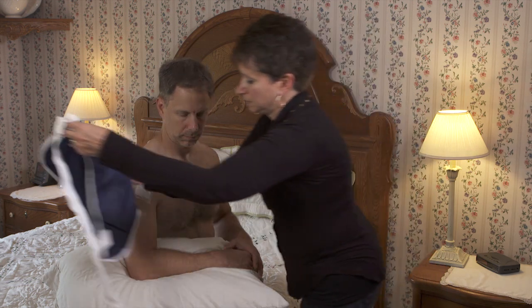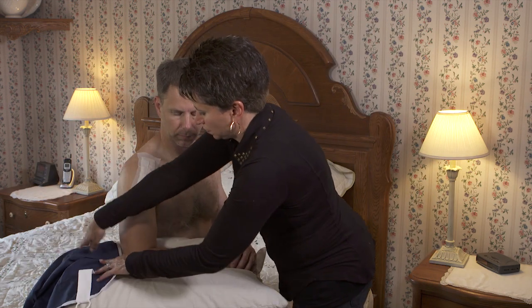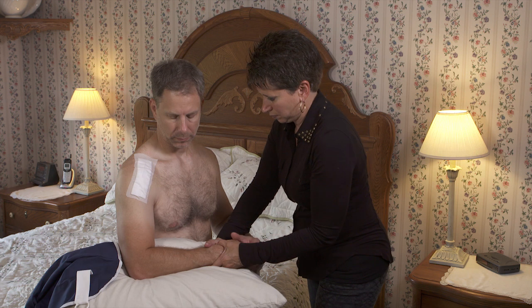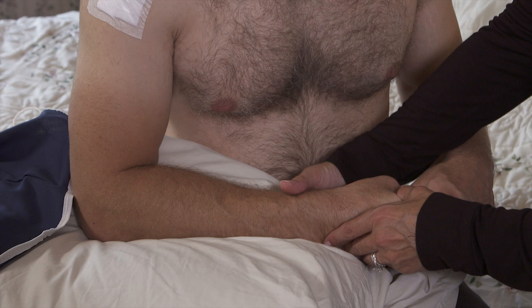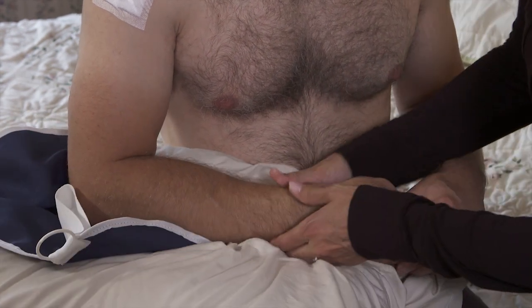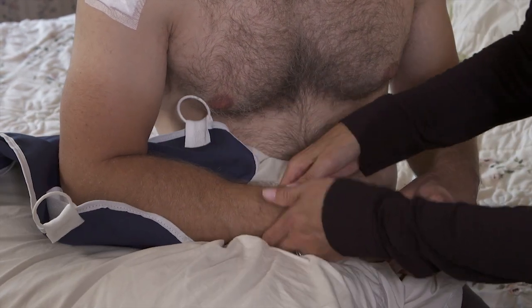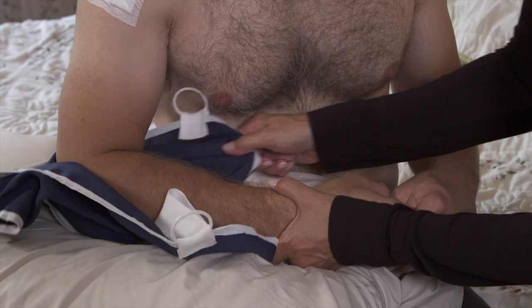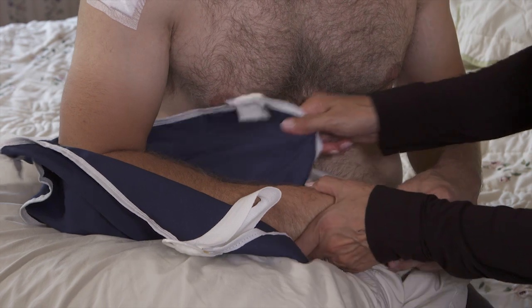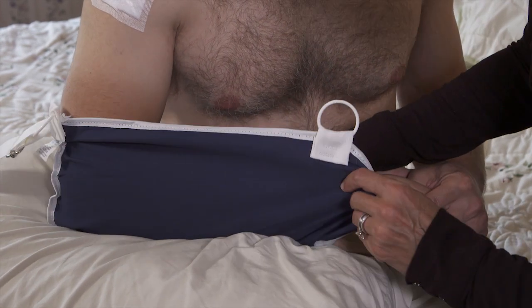To put the shower sling on, your helper puts the sling in place by your elbow. Your helper stands so he or she is looking down the length of your arm toward your elbow. Your helper should hold your wrist to keep your healing arm from moving. Your helper pulls the sling onto your arm a few inches at a time, switching hands as needed. Your helper does not lift your arm. Instead, he or she presses down on the pillow to get the sling under your arm.